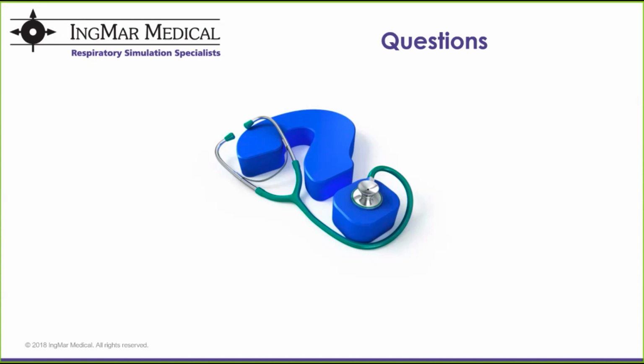But our goal is to expand that as we continue this relationship with Laerdal. We would very much like to be able to integrate with an expanded number of mannequins. The ASL 5000 itself is certainly capable of producing breath patterns from neonatal to adult, so that functionality already exists with the current ASL 5000. We would very much like to move in that direction.